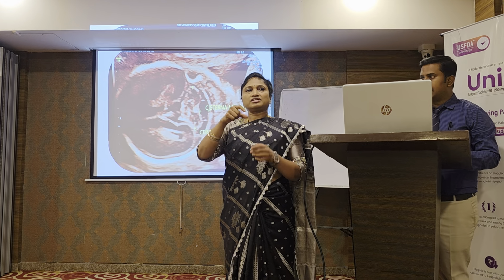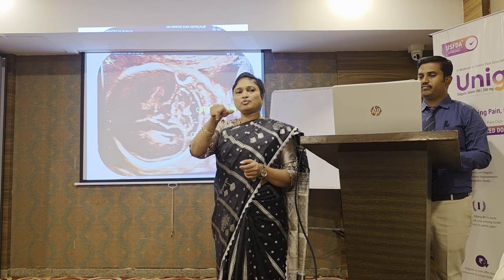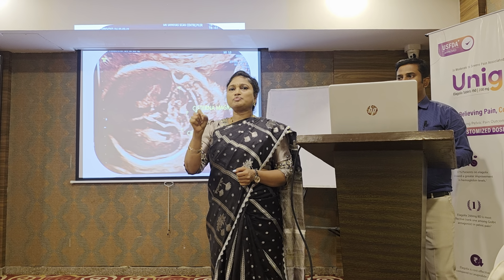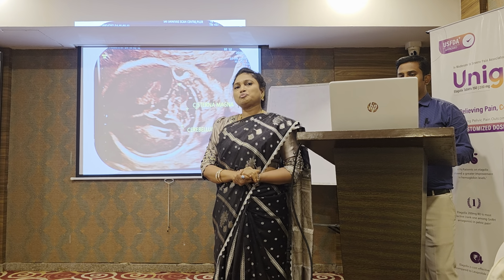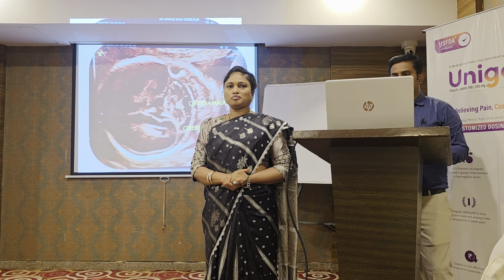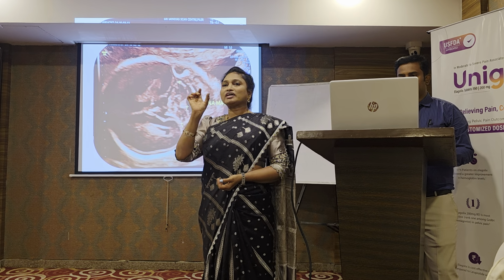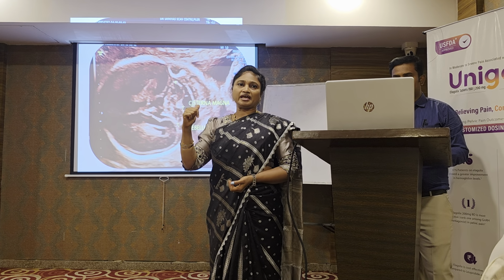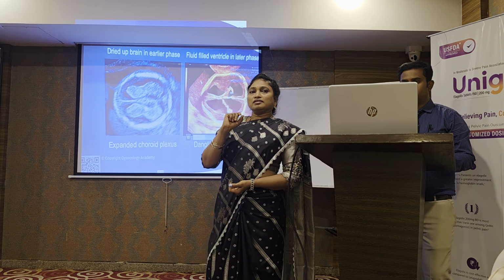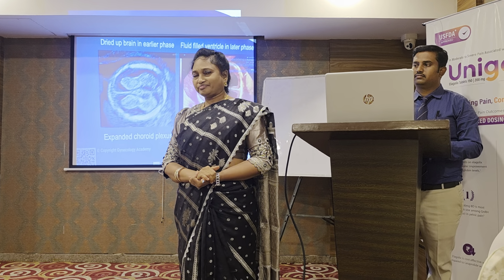The fourth ventricle, if it is dilated, or if there is a communicating canal between the fourth ventricle and the cisterna magna, always be careful about vermian hypoplasia, which again leads to a lot of coordination as well as motor problems. So in this again you have to go for the mid-sagittal plane where you can actually see the vermis and measure the vermian angle. Next one. So dilatation of the lateral ventricle, is it important?